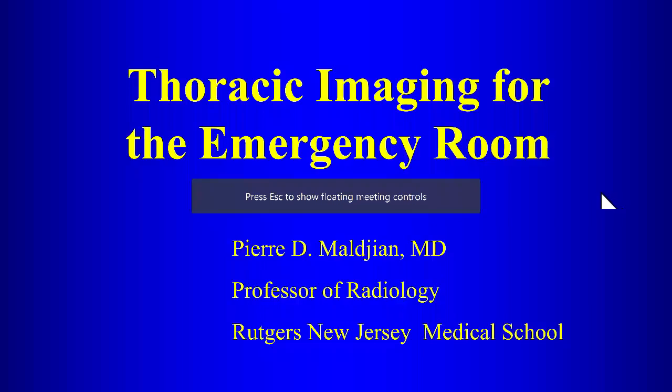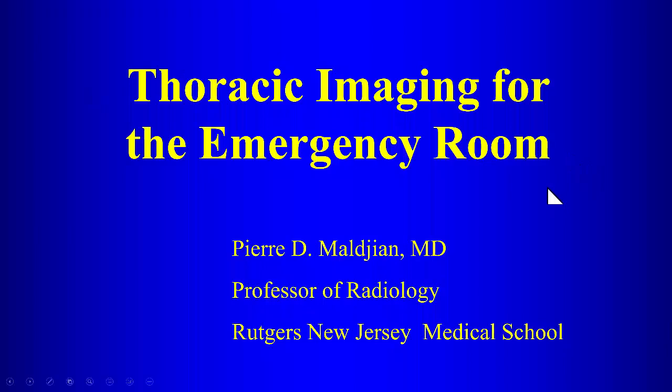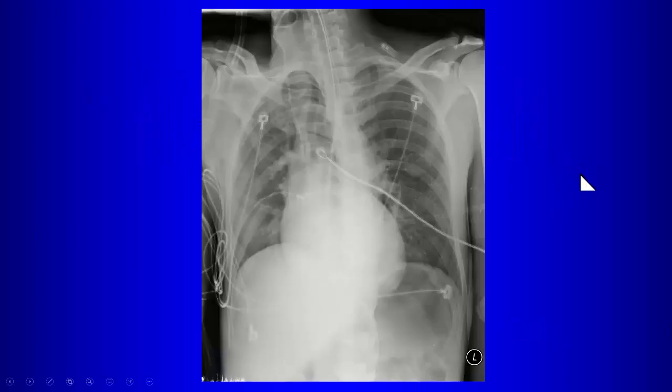Okay, so the next few series of conferences is going to be geared towards emergency room radiology, and it's mostly geared towards the first years and the second years. For the cases that I present, I would like first years and second years to speak up and tell me what you think, okay? So we'll start with this case.